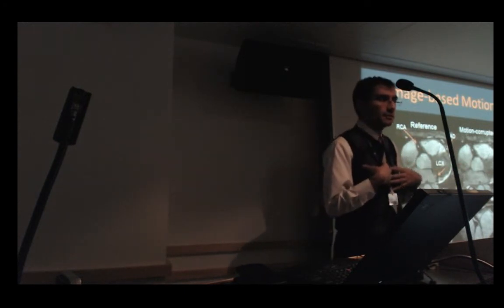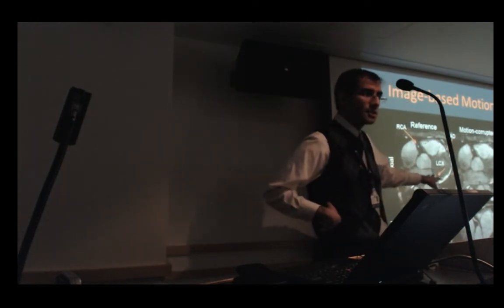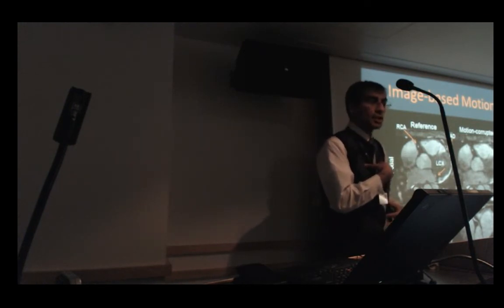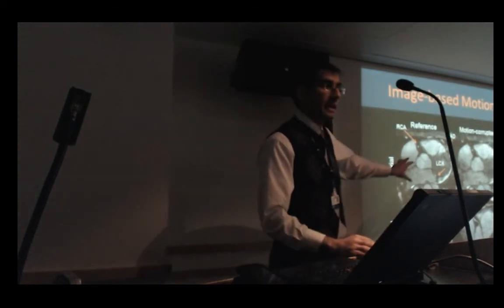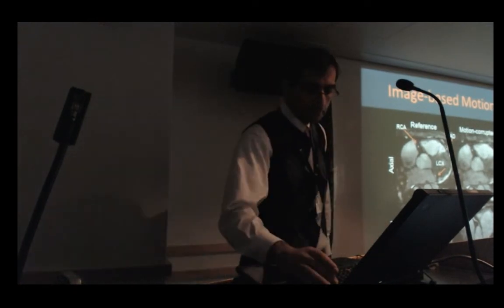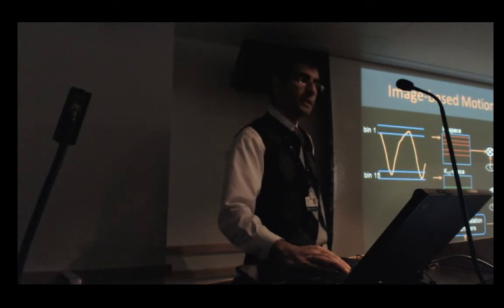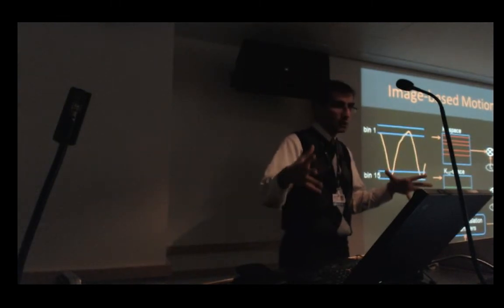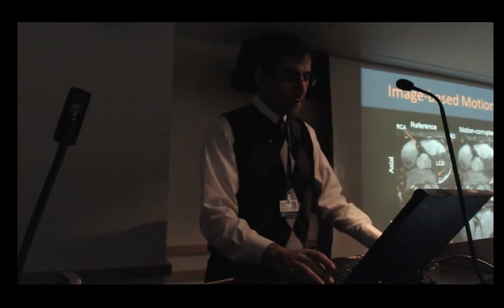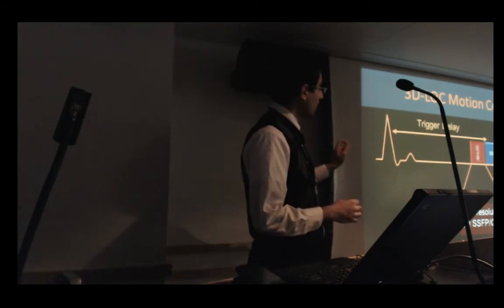A good point that came out is that when I have whole heart images, I would have the images of the heart and the chest wall and the back wall spine in my field of view. So I don't have a pure translation parameter. It's going to be a non-rigid transformation, because I have a static region of the chest and the back wall that doesn't move. That static region would create some artifact in my images, because when I'm correcting for the translation parameter, basically I'm correcting for the motion of the chest that doesn't move at all. That would create some artifact that would reduce the SNR.